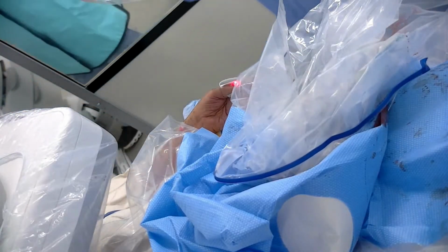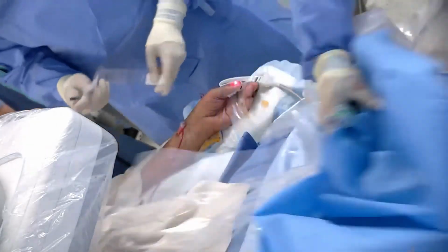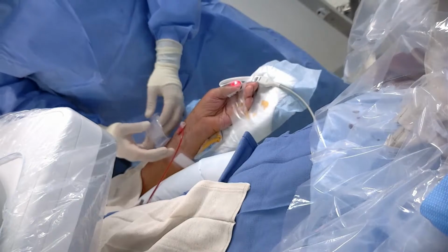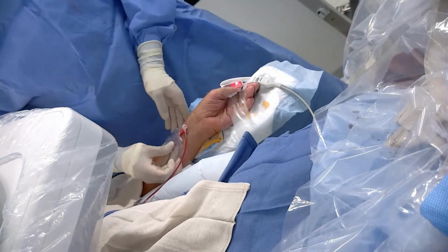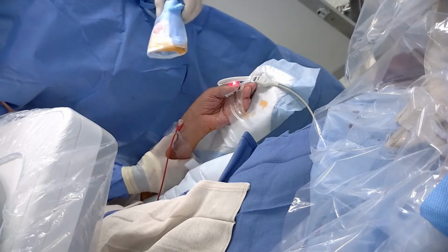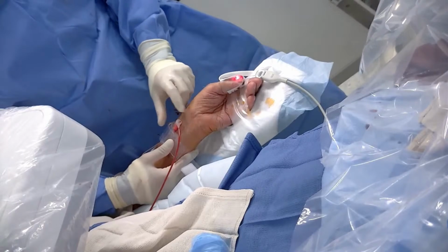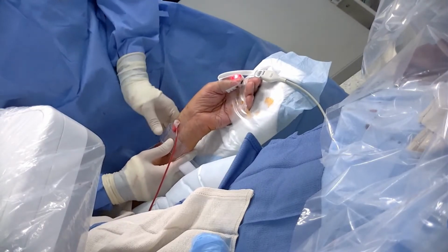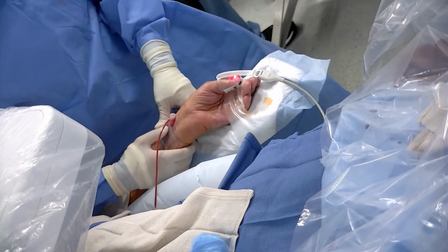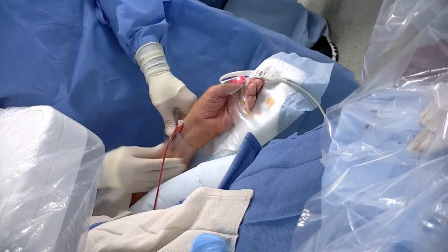Here's this TR band. And then I know they have that proprietary syringe. How do you secure that, so we send it to the PACU? How do you prevent that from being lost? We'll tape it to the patient's chart. We used to tape it to the patient's forearm, but now we tape it to the chart. That is one of the more annoying things about the TR band, the proprietary syringe, because you can't just use a regular syringe. So if you lose it, you either have to open up another band. I think it's a scam.